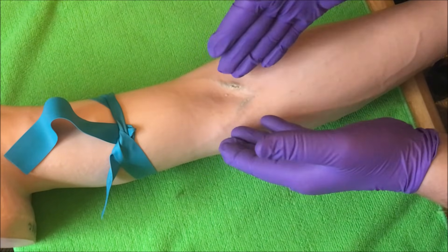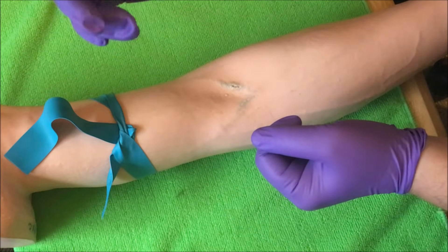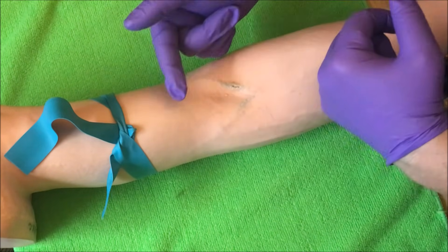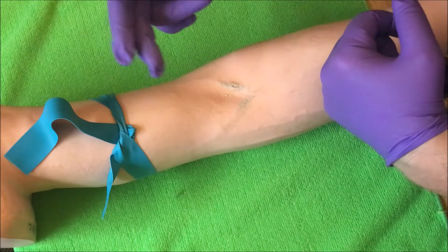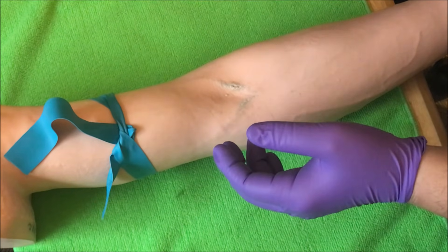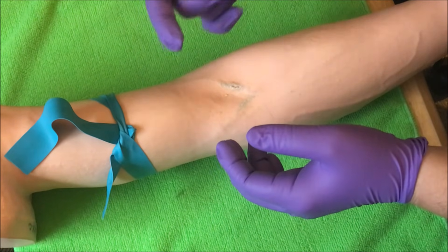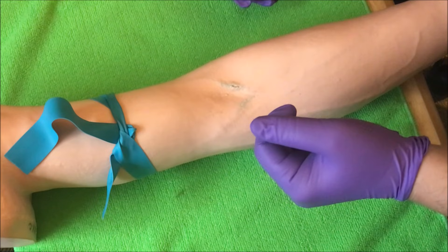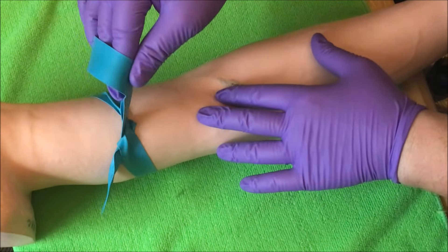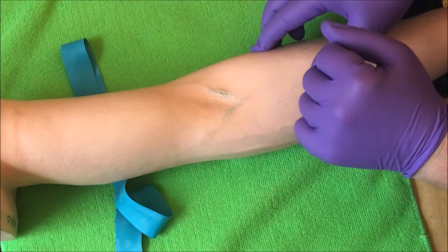It's not too tight. I'm not looking to restrict blood flow completely — I want to restrict it just enough so the vein stays steady and I get enough blood flow. If I put the tourniquet on too tight or too high, I might not get any blood flow. So three to four inches above the site to prevent hematoma, no longer than one minute so hemoconcentration will not take effect, and not too high so I still get enough blood flow. When I'm done, retract and pull toward you — and you're all set.